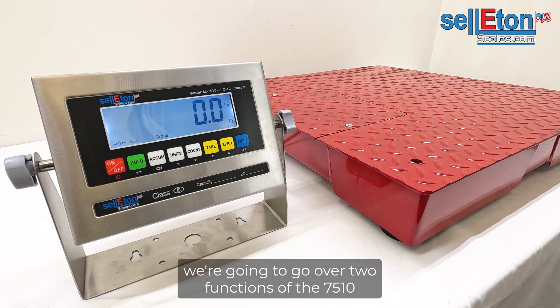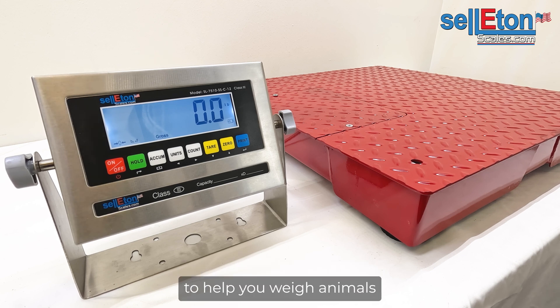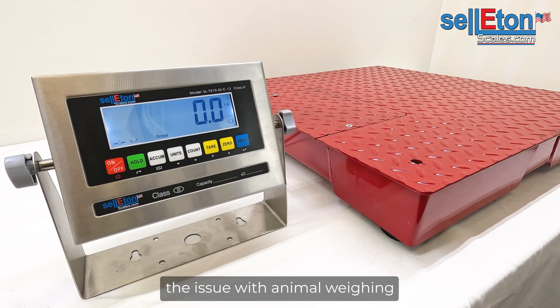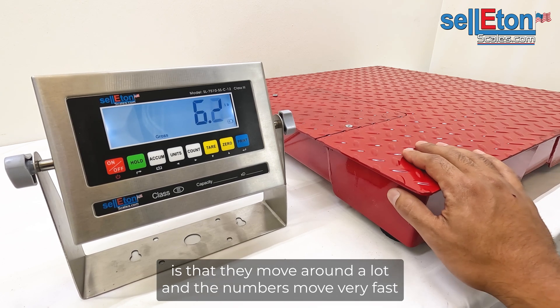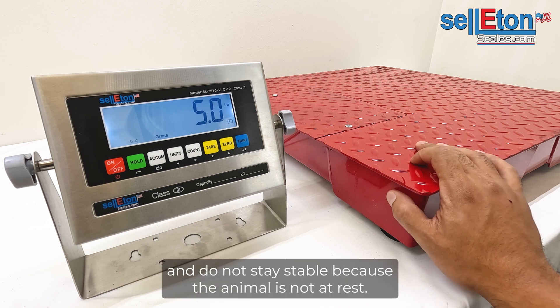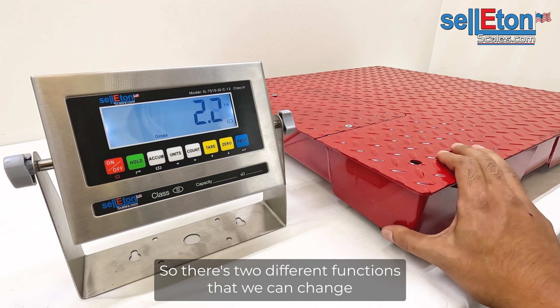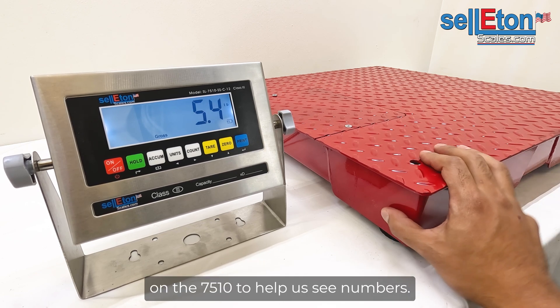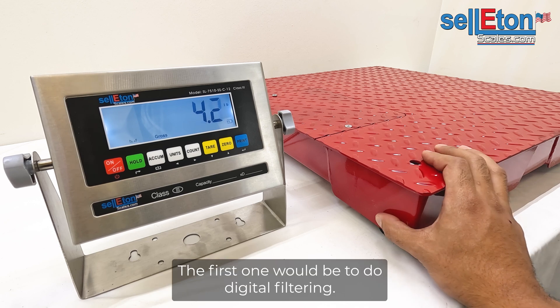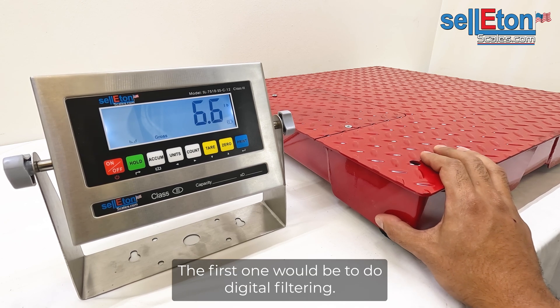In this video we're going to go over two functions of the 7510 to help you weigh animals. The issue with animal weighing is that they move around a lot and the numbers move very fast and do not stay stable because the animal is not at rest. So there are two different functions that we can change on the 7510 to help us see numbers. The first one would be digital filtering.